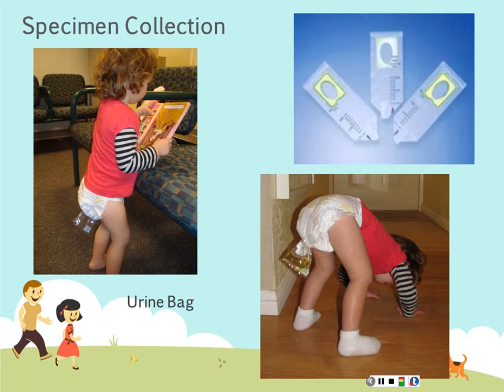The way you would use them is you'd either cut a small hole in the diaper or pull it out the side of the diaper so that you could see when it was full. The problem with this is children are mobile. It is very hard to get them to stick well. So you definitely could not use these for a sterile urine collection.